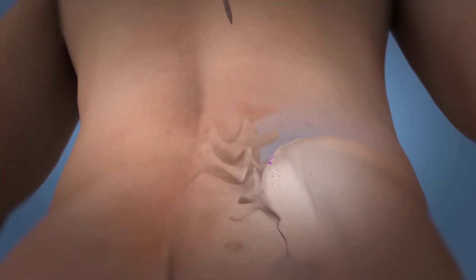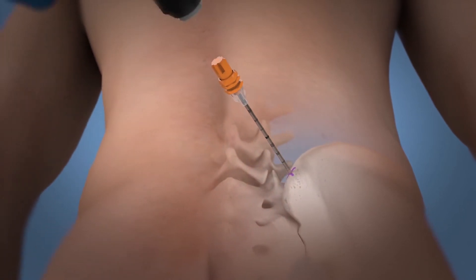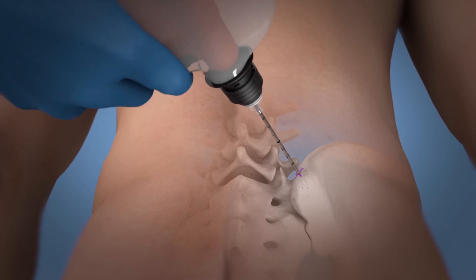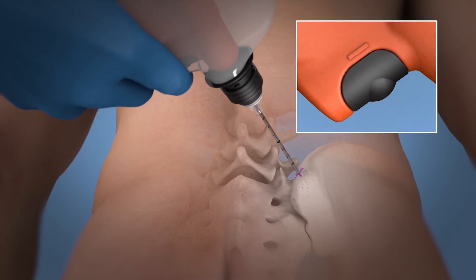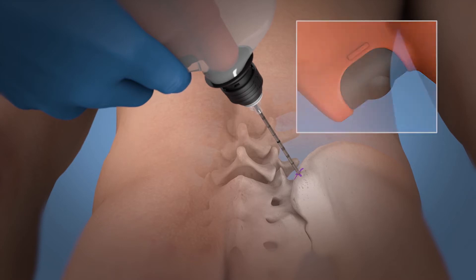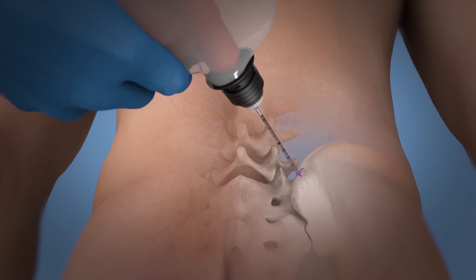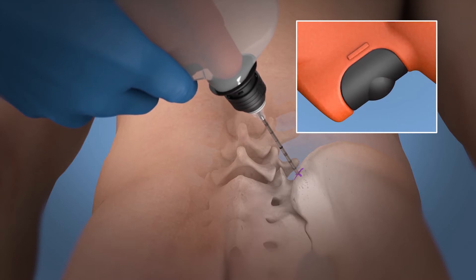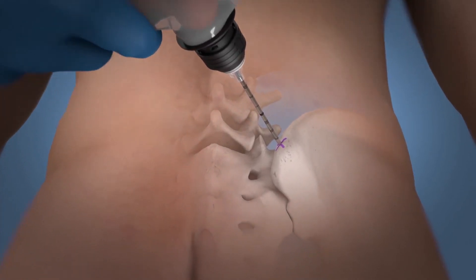Insert the needle manually through the patient's soft tissue to the periosteum at the desired location and angle. Gently attach the OnControl driver until an audible click is heard, which indicates attachment. Engage the driver trigger continuously with one to two pounds of downward pressure to penetrate the cortex.